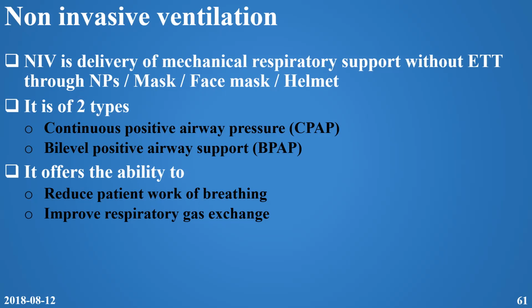So that's the meaning of continuous positive airway pressure, CPAP. Any question about CPAP? It's continuous, meaning the same pressure during exhalation and inhalation. It's positive because it's above atmospheric pressure, and the pressure is going to the airway. That's why it's called continuous positive airway pressure. Clear?